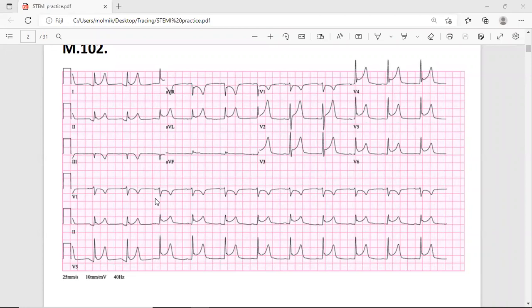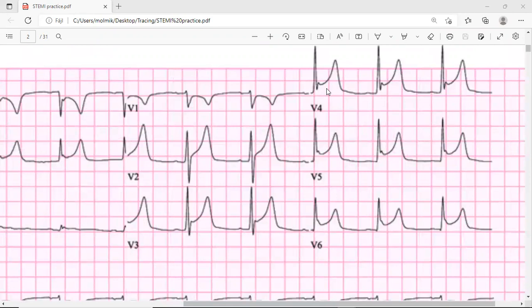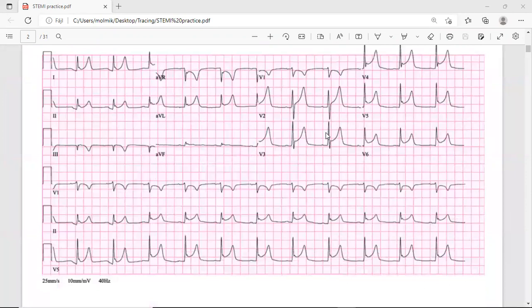And so when we look at the QRS complex, it's narrow. Well, I thought it was narrow, but there's like a notch at the end of the QRS. It's narrow. In some leads you can see some notching, for example in V4. But again, it doesn't mean anything. It doesn't mean that you have, for example, hypothermia. No, it's nothing.